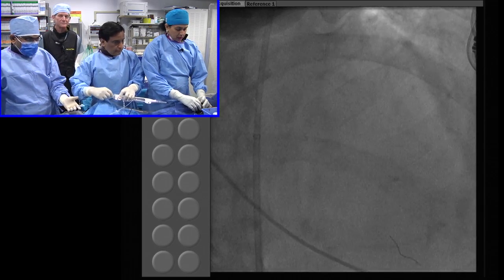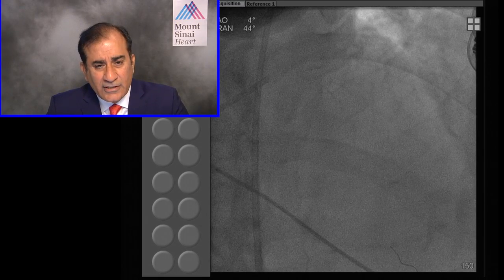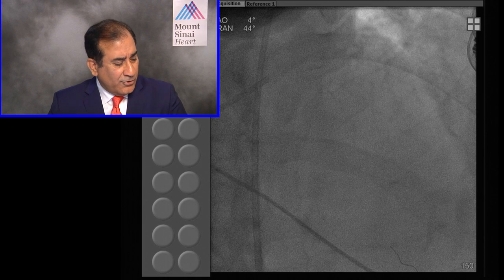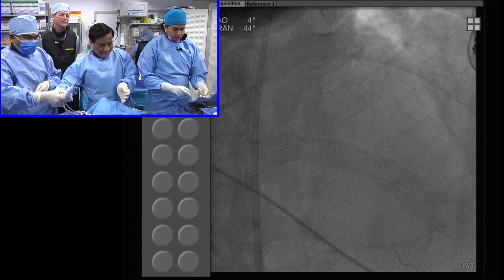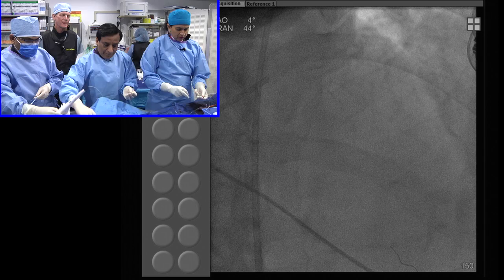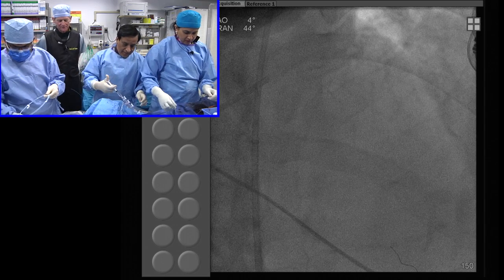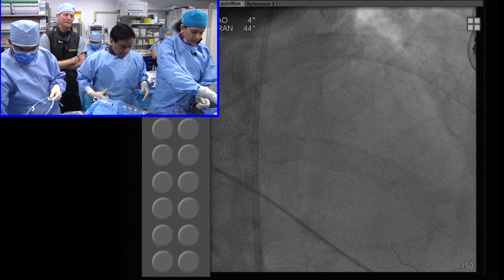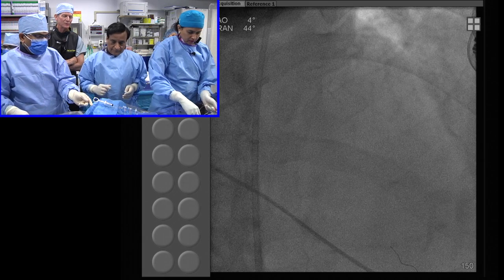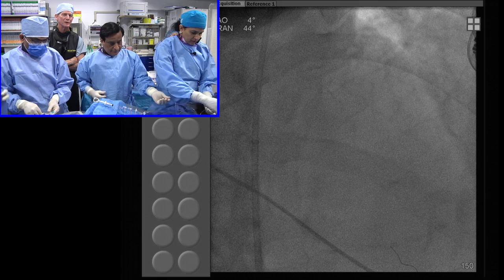Chuck, do you think BVS has taken us a step closer to preventative interventions? So ask that again. The preventive prophylactic PCI for vulnerable plaque. Are we a step closer to that? Yeah, I think it brings us one step further because it's not a permanent implant, right? And if you're going to treat a vulnerable plaque with an implant, you don't want it to be a permanent implant for what's really a temporary problem.